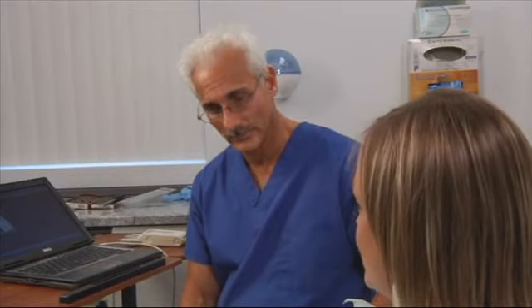So that's one of the advantages of disclusion time reduction. It automatically balances the bite and closure for the patient, speeds up the process of doing occlusal adjustment therapy.